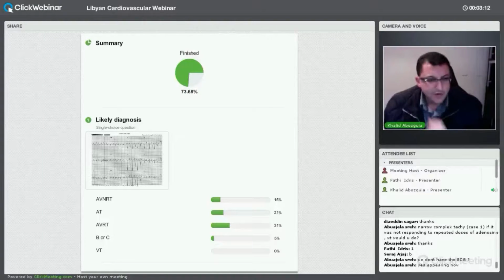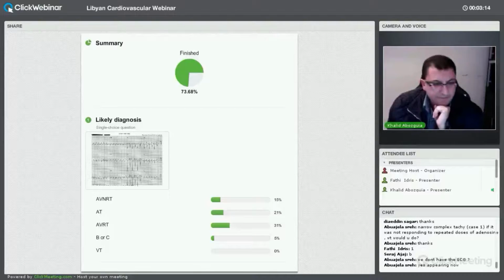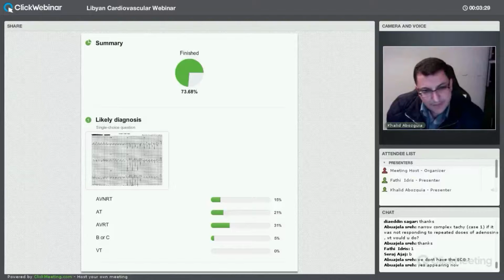Okay, I hope you could all see the results. The majority answered AVRT. A few answered AVNRT, and about 5% chose both atrial tachycardia and AVRT. So I'll go back to my presentation.